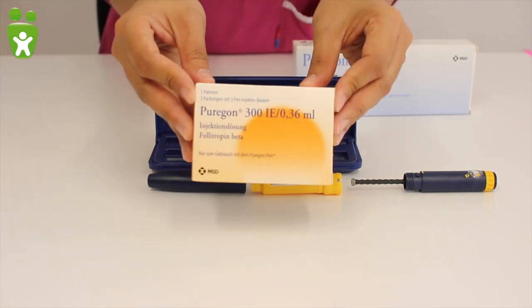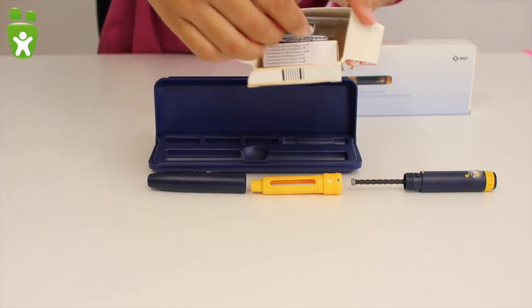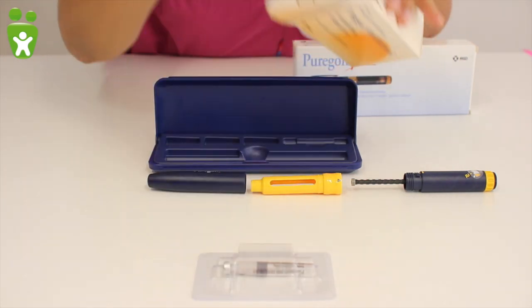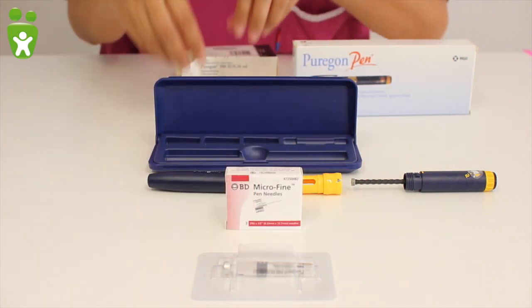The medication can be found in a separate box. Here you can see a box with 300 units. The medication itself is in a glass vial. Additionally, you will find needles in the box which should be changed daily.